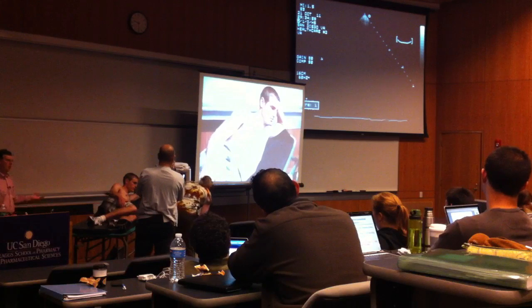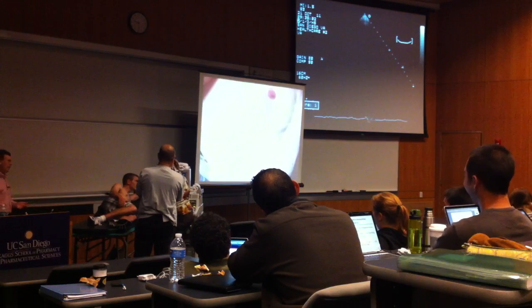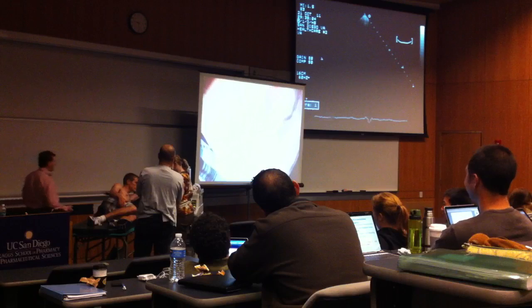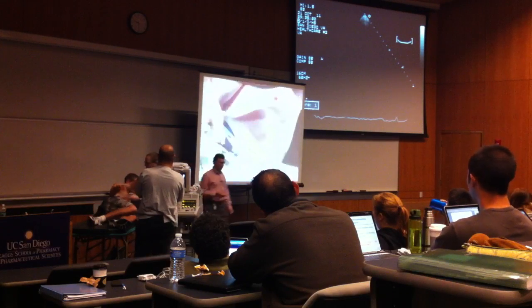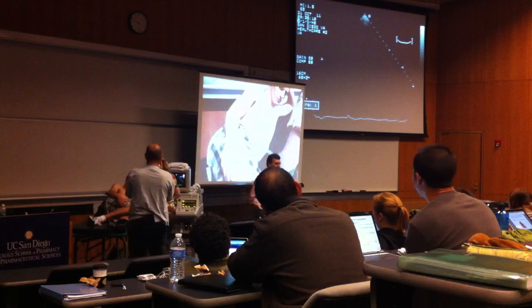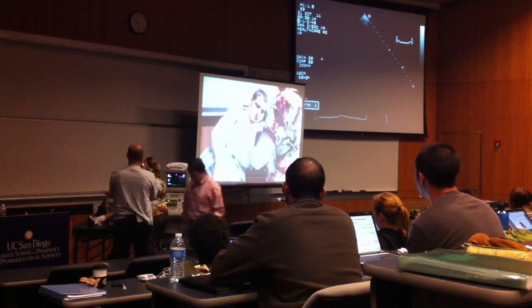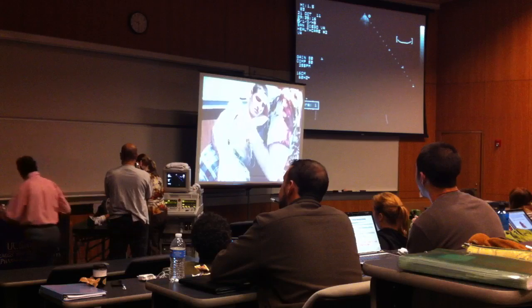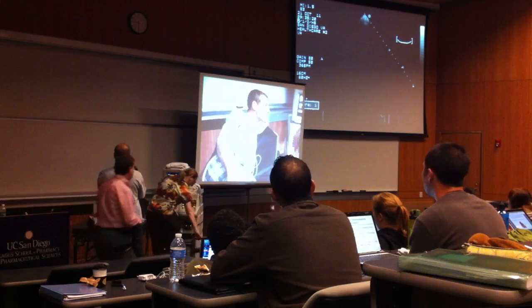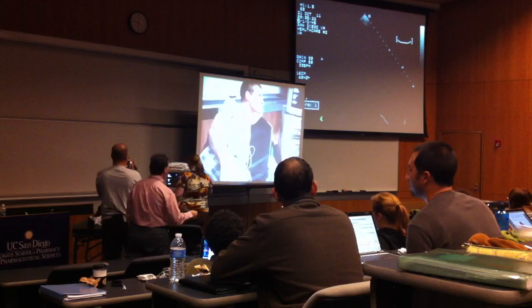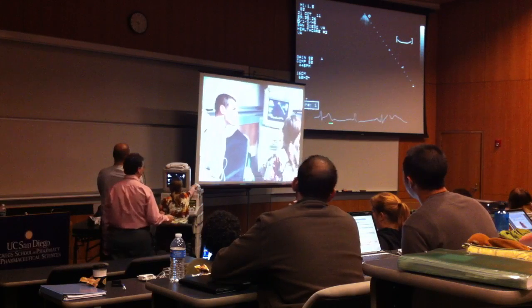Kelly is first putting on these stickers that we use to acquire the EKG. As we mentioned, it's essential that we use the information from the ECG to time events of the cardiac cycle as we're firing echo pictures. You'll soon see down below — here comes our EKG, ECG.